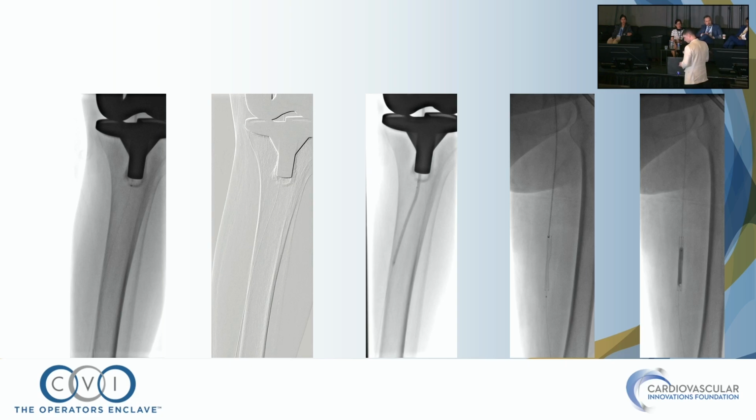This is someone that we're going to be putting on anticoagulation. Maybe even you do Lovenox initially versus doing one of the NOACs right away. At the point that you have here, I don't think I would chase further down the AT for sure. Agree. You need to get at least some flow to the foot. I just agree.